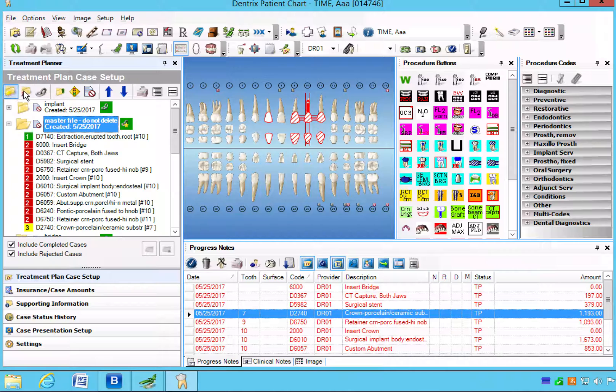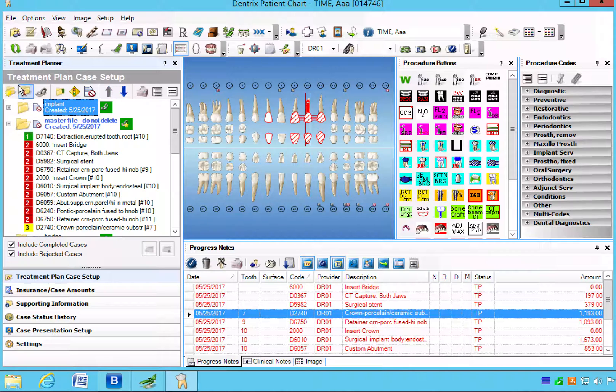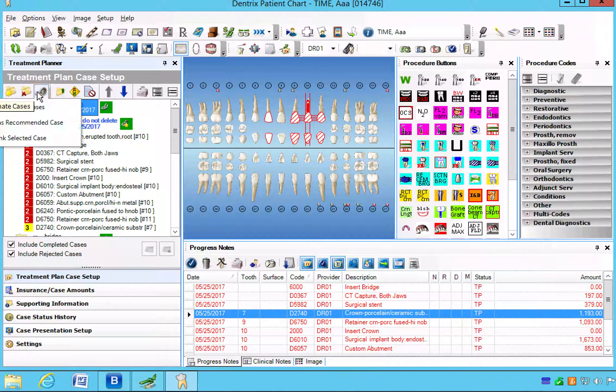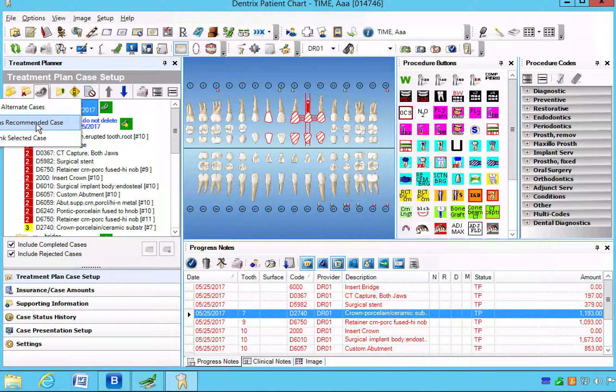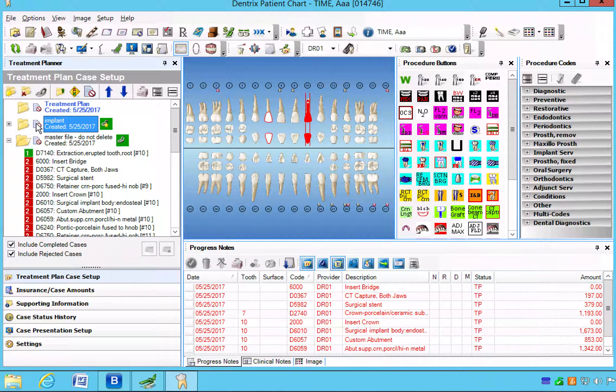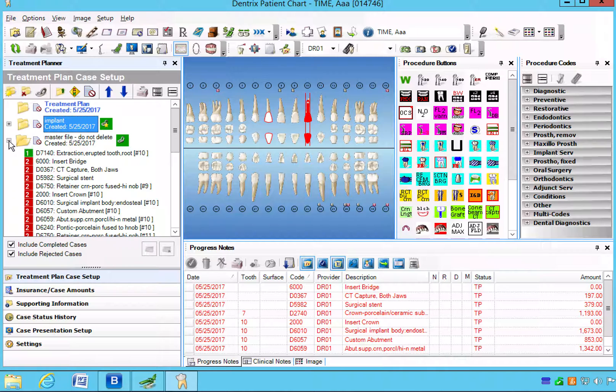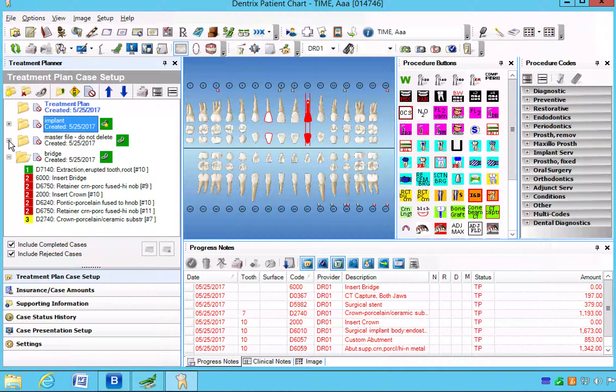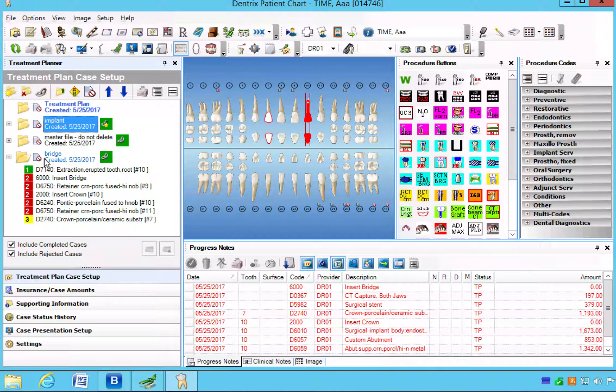So for now we're going to set our implant to recommended and you'll see the bridge disappear.